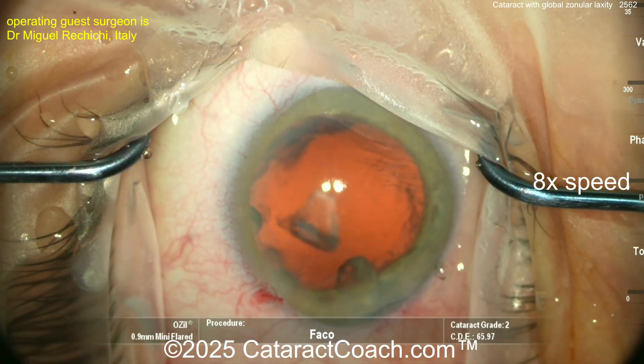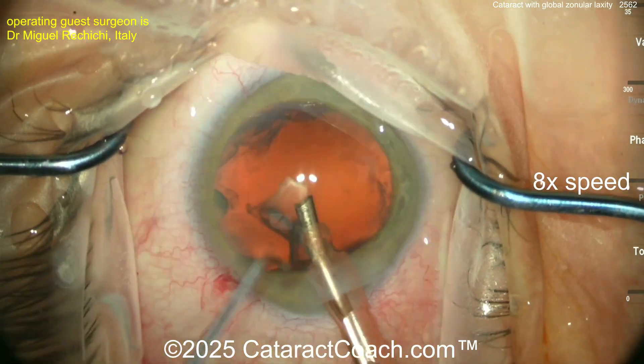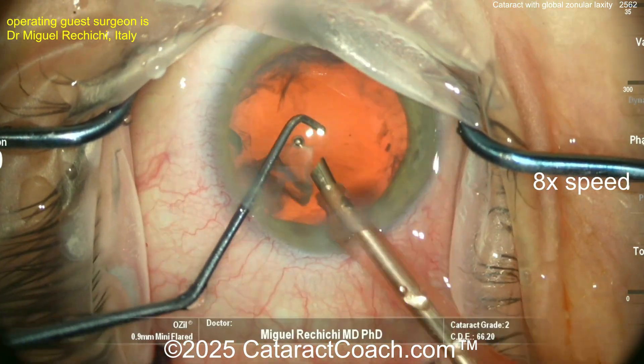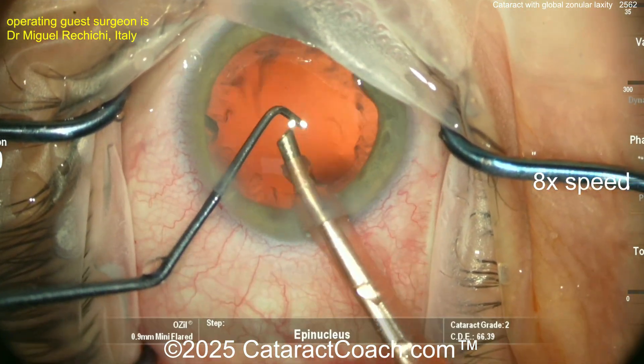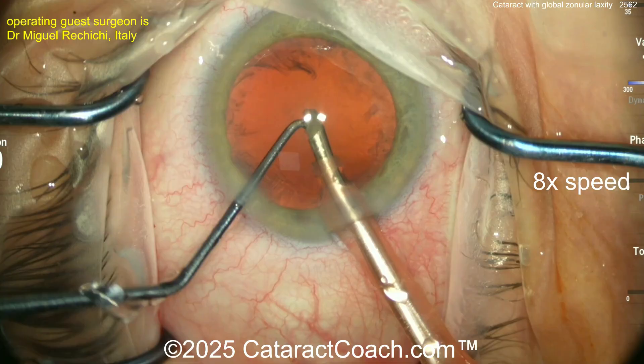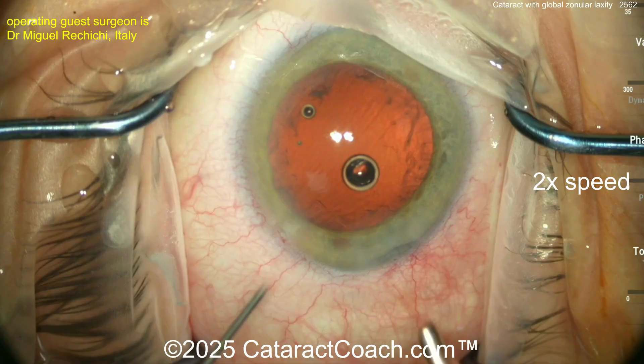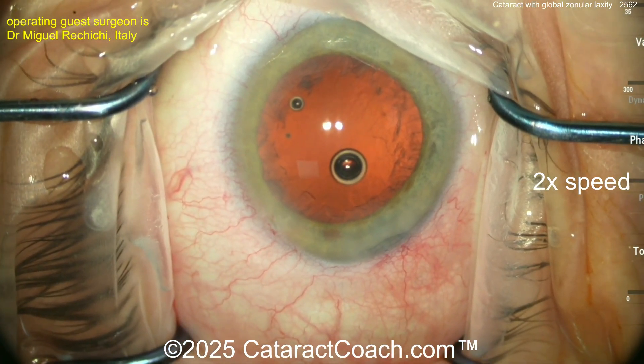You can actually just pull these pieces out of the incision, or go in with a phaco probe again and aspirate these last couple of tiny pieces. The bag looks pretty clean. I like the technique of putting in more viscoelastic here and not letting that bag collapse. Very little cortex remaining.